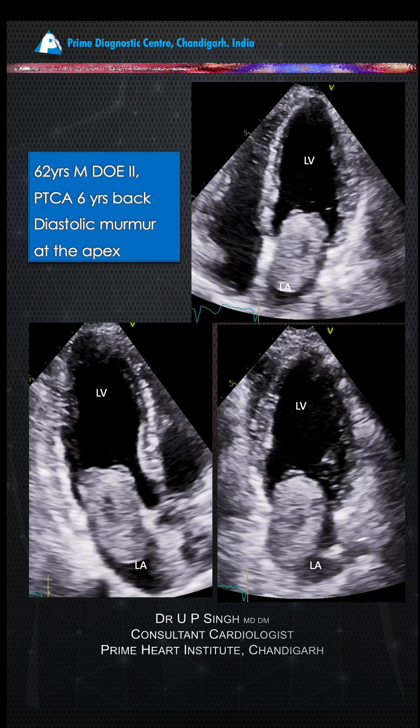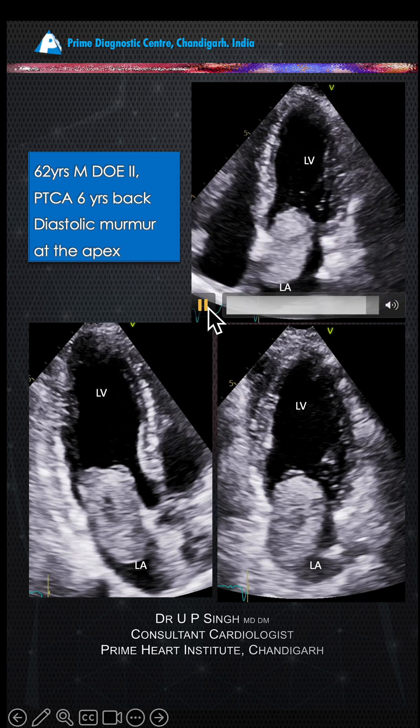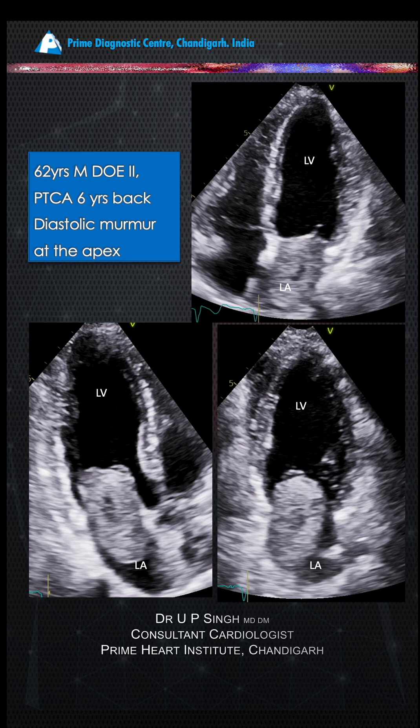A patient came in with dyspnea on exertion and post-angioplasty, and was referred for a stress echo. You're going to see why we didn't perform a stress echo on this patient — there was a diastolic murmur at the apex. Now you can see there is a large mass popping in and out of the left atrium.